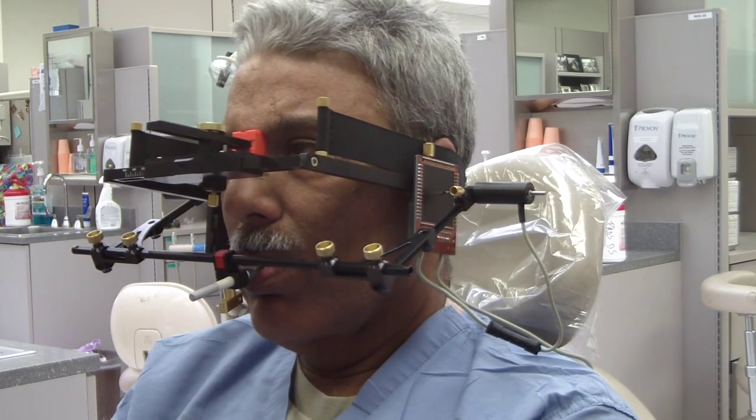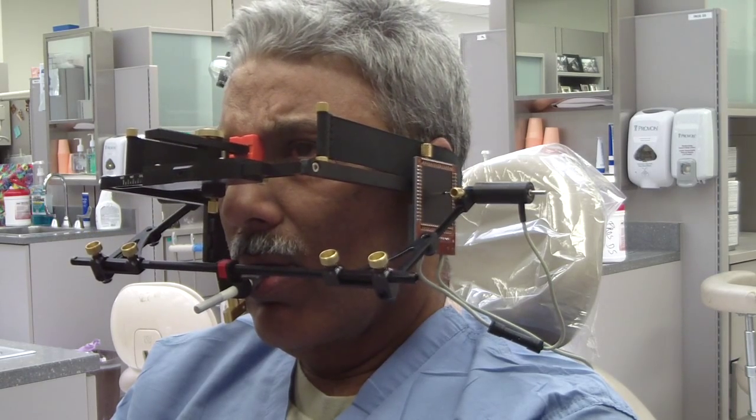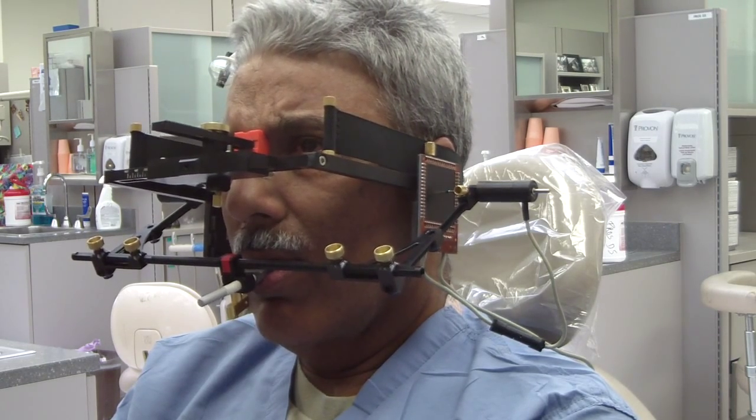So that's another way to find out, aside from the immediate mandibular lateral translation, whether the patient has a TMD issue or not. That's a good device.